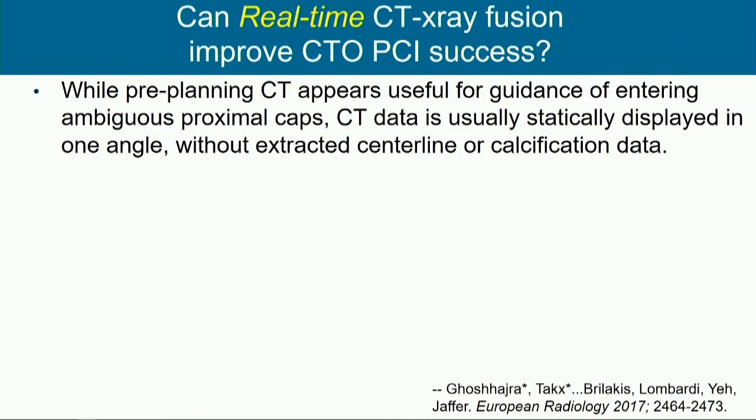So we started asking the question, which was actually looked at maybe 10 to 12 years ago, about real-time CT guidance. There were a few anecdotes using wires, seeing if we could extract the center lines from the CT, map them on the X-ray system, and have them rotate together. Could we do a better job? Gerald Werner really looked at this some years ago and showed that we could get wires down, but the more complicated subsets had really not been explored.